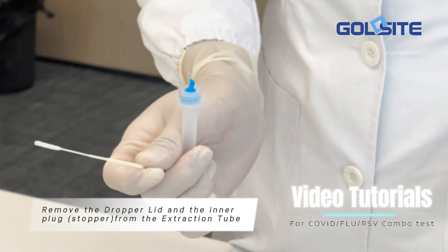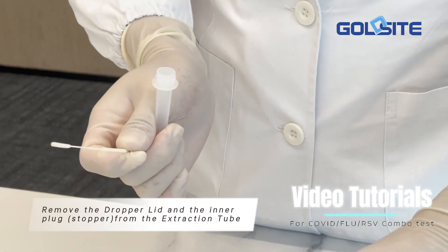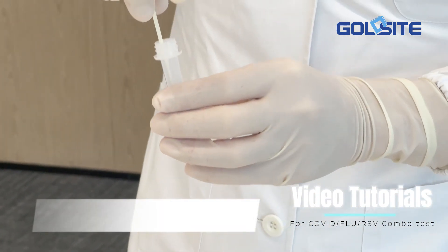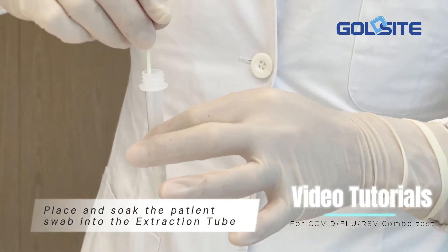Remove the dropper lid and the stopper from the extraction tube. Place and soak the patient's swab into the extraction tube.